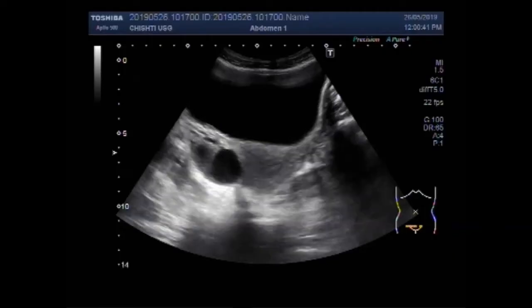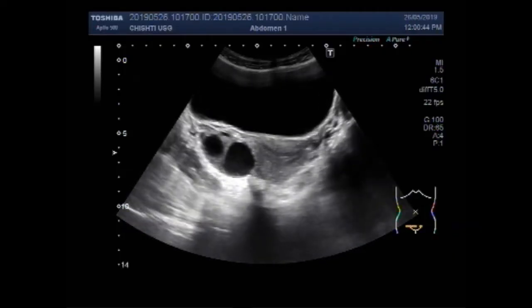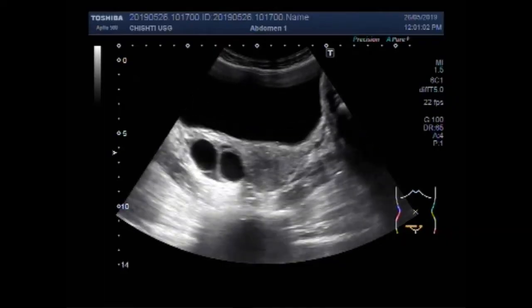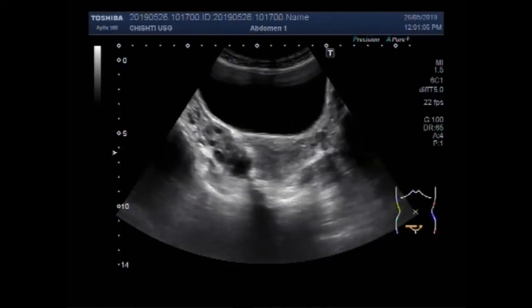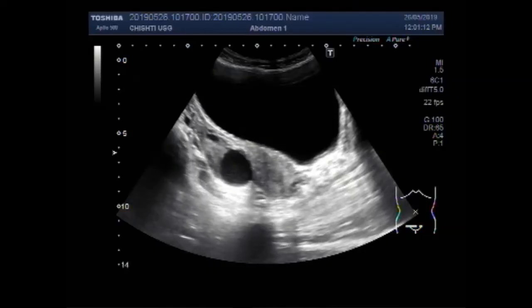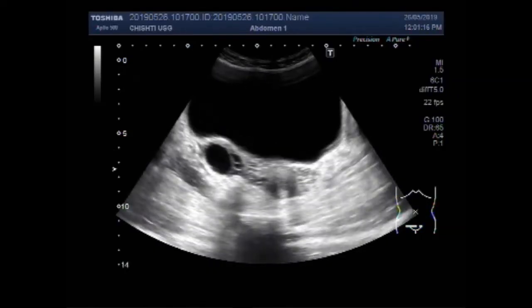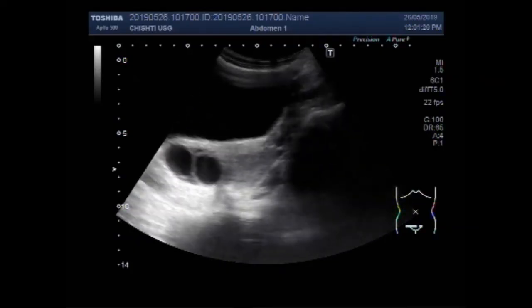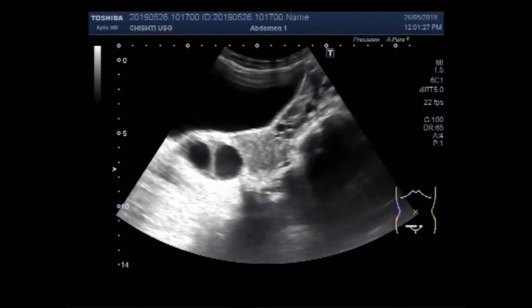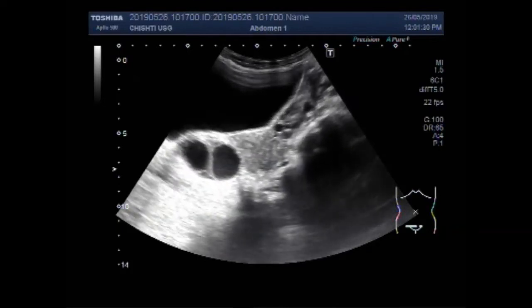Now these are the two ovarian cysts. The cyst lying medially is a hemorrhagic cyst, while the cyst lying laterally is a simple ovarian cyst. This is the right ovary and this is the left ovary. Now you can see both the ovarian cysts. This cyst has a turbid fluid in its interior, and now this one lying laterally has a clear fluid in its interior. You can see the difference in the echo density of both the cysts.